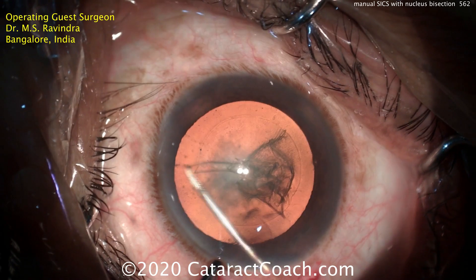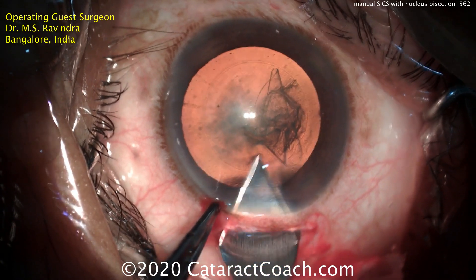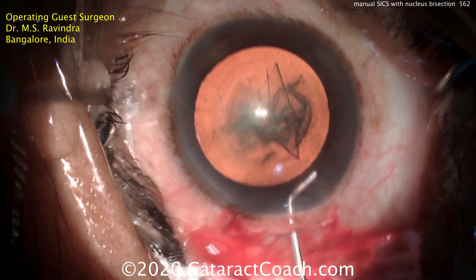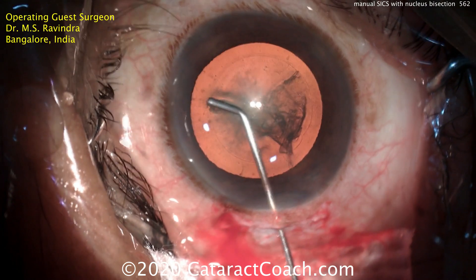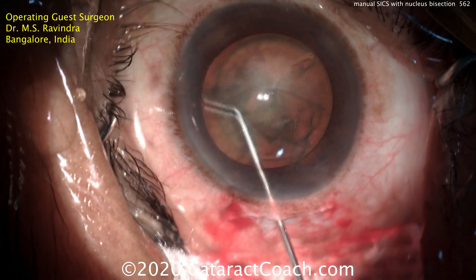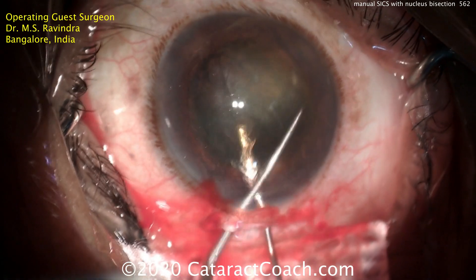Now it's time for hydrodissection. Before doing the hydrodissection, he's going to enlarge the incision to the full six millimeters, making the inside tunnel a little bit larger as well. Here's the balanced salt solution — a nice fluid wave going across with continuous fluid dissection until the nucleus starts to prolapse out of the capsule bag. Now dialing the nucleus completely out of the capsule bag, just like that.